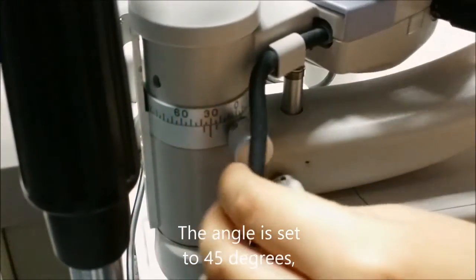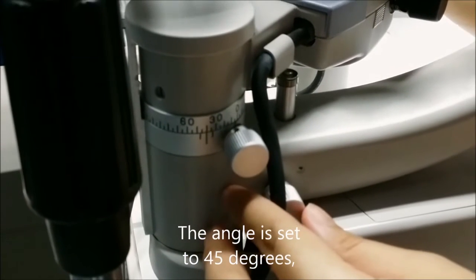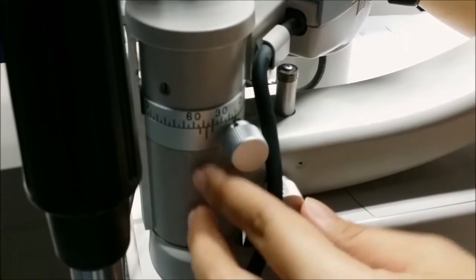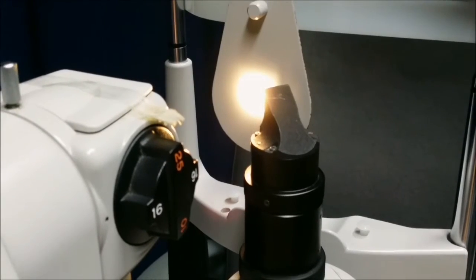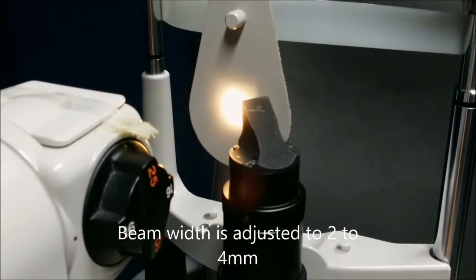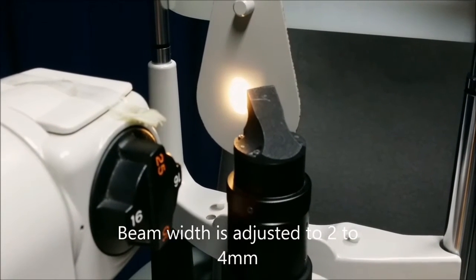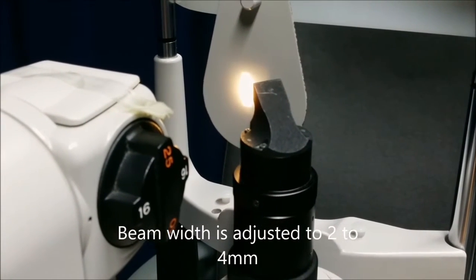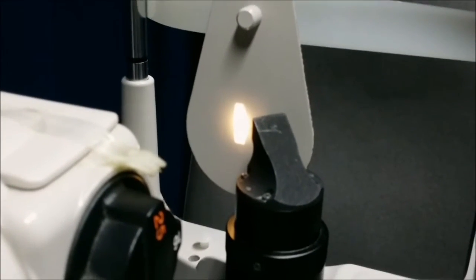The angle is at 45 degrees. The beam width is 2 to 4 mm.